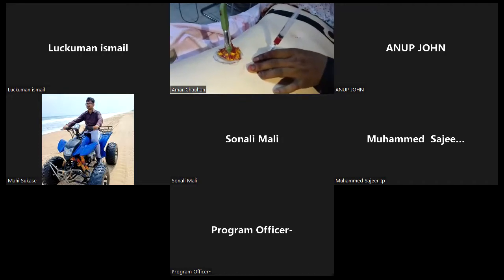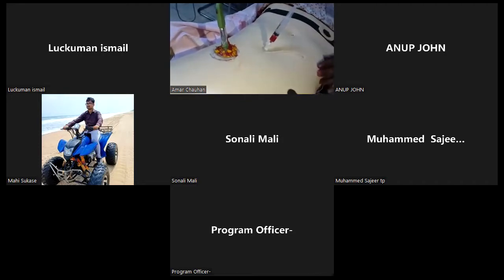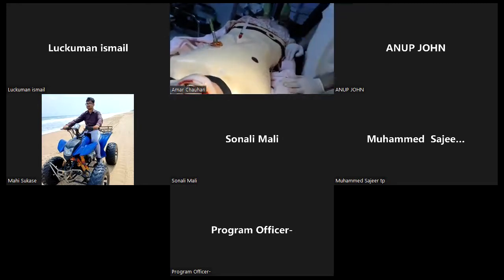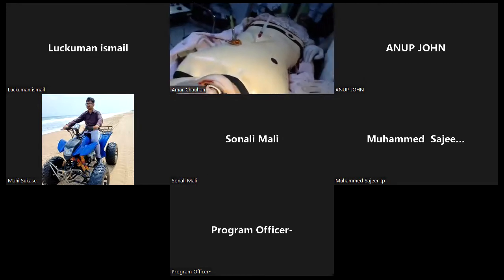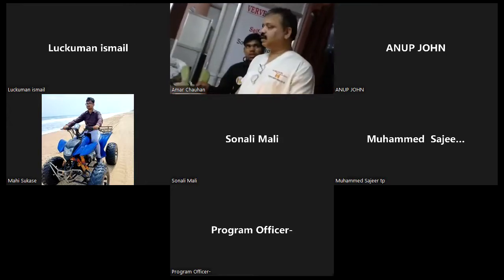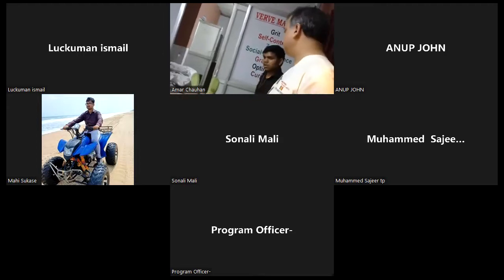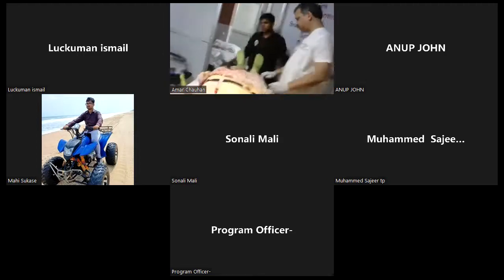So there are various skills we can perform, and these are the various features we can run from a scenario. Okay, so that was our Moulage patient. Maybe I have missed one or two features. Now we will go for the ICD demonstration. Chest tube, how to put a chest tube in our mannequin. That's a chest tube.